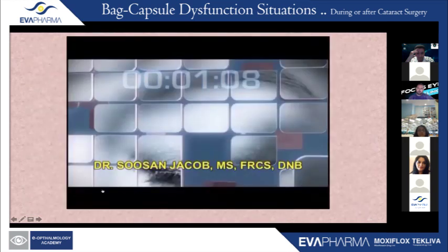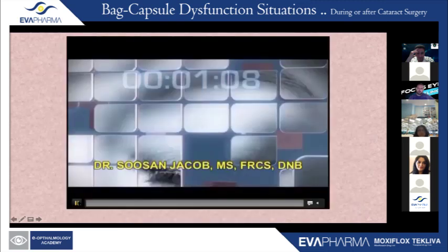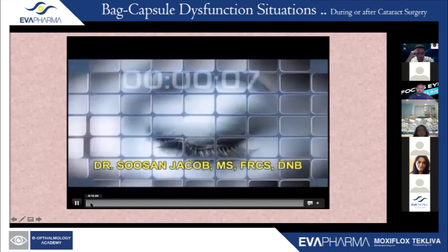I'll just show you one more quick video. This was published in 2013 in my YouTube channel. And this is an interesting case because now this child has grown up.